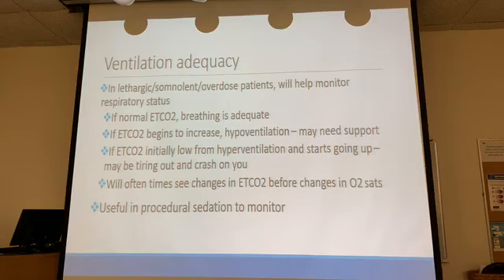If it's going up, that means he's starting to hypoventilate. They're not taking good deep breaths. If he overdosed on something, maybe he's getting deeper into the overdose and he's becoming more sedated from the 100 Xanaxes that they took. And what you're going to see is the end-tidal CO2 start going up before you even see a drop in the O2 sat.